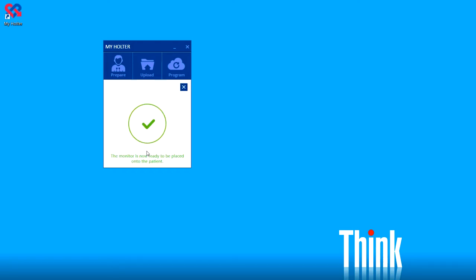A momentary progress screen will be displayed. When preparation is complete, a check mark appears indicating that the Holter monitor is now ready to be connected to the patient. We'll pause here and move to the Reports tab. We'll continue with the patient's preparation and monitor connection after we've finished the Arrhythmia Access tutorial.